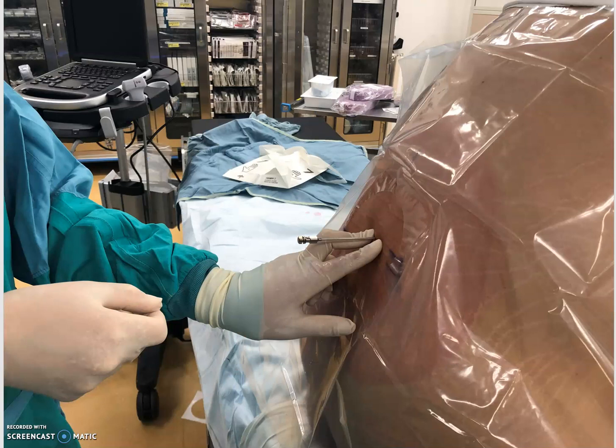My next step is to do a spinal with my 25-gauge Whitaker needle to make sure I have CSF on the track before I go in — not everybody does that. Some people will start with just local infiltration and then use the spinal drain needle like they would do an epidural, using it as a Tuohy with a loss-of-resistance technique.